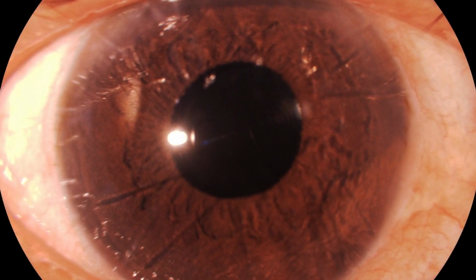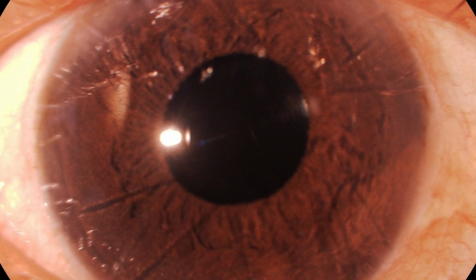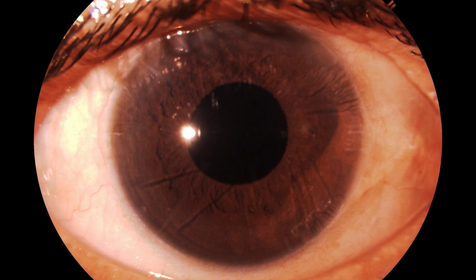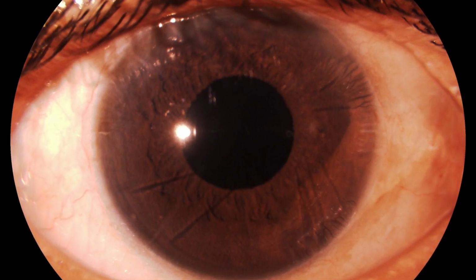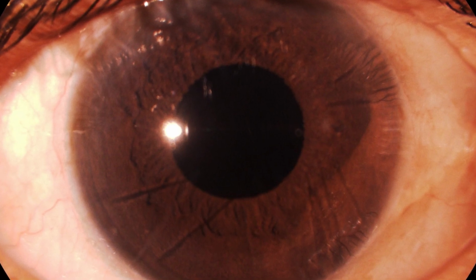There was no residual spherical error, and this is good for the patient because the biometry was accurate as predicted by the Universal Barrett 2 formula, and I would recommend that to be used in these patients who have undergone radial keratotomy.